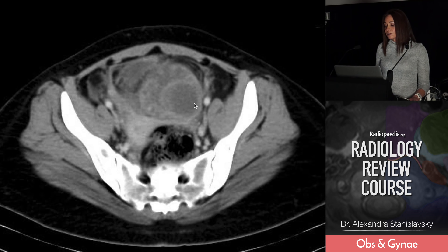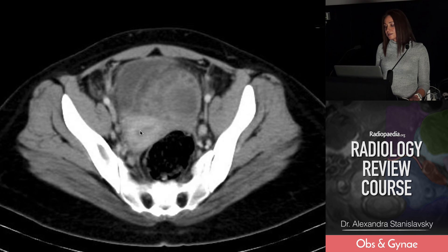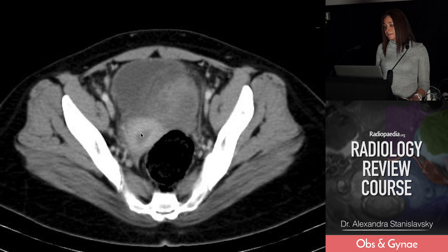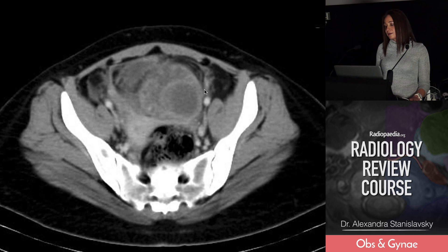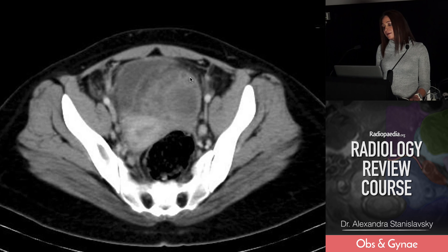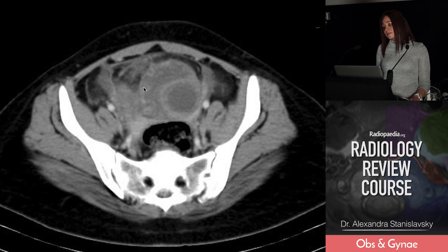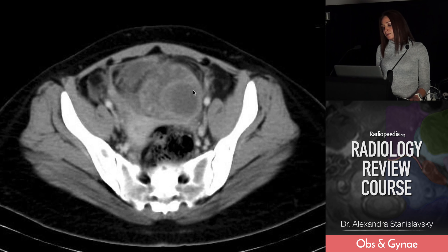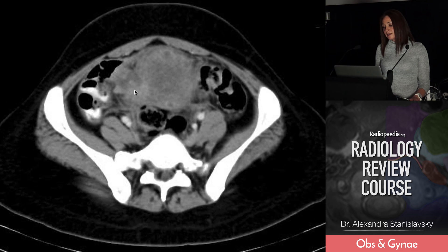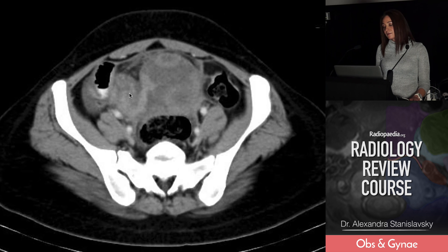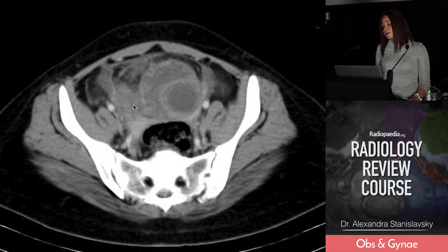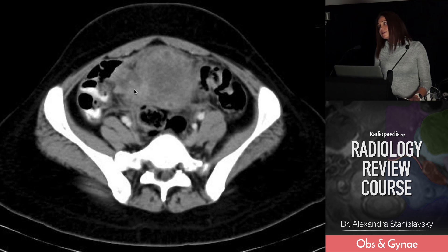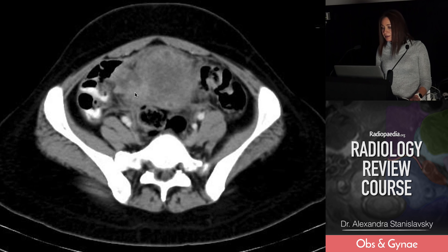This is the patient's uterus here, and this is her ovary. You can see an edematous ovary with peripherally displaced follicles and a large corpus luteum, and right here is the twisted pedicle coming through. This is diagnostic, and I wouldn't say this patient needs ultrasound for confirmation — I think she'd need to go straight to theatre.